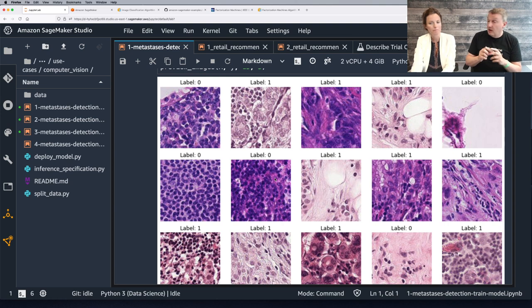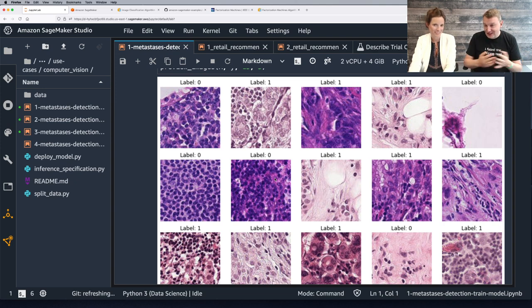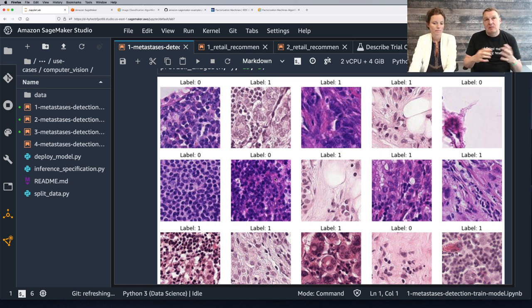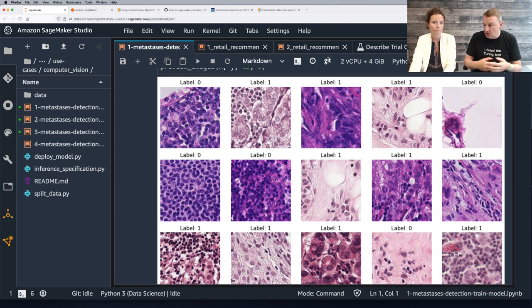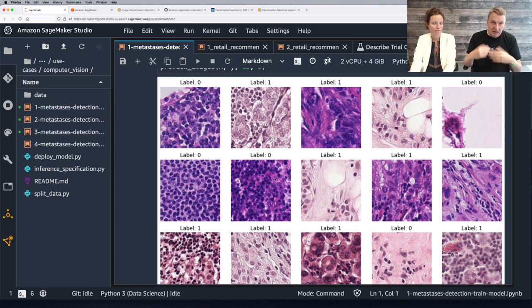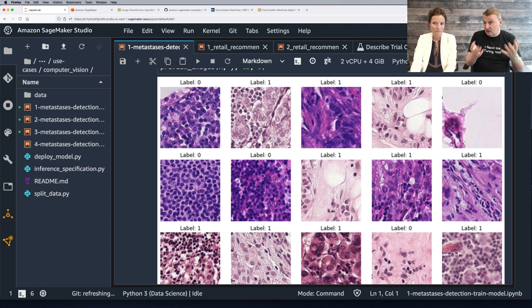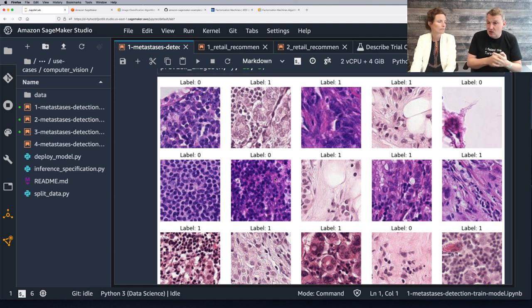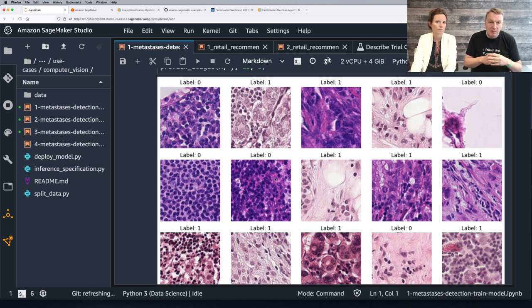These are small images — 96 by 96 pixels, so not a lot of pixels. But let's see how well we can do. Working with small images is always better when it comes to training time and compute requirements. You would intuitively think you need high-res 4K by 4K images, but for most computer vision applications, we can actually get good results with small images and get them quicker.